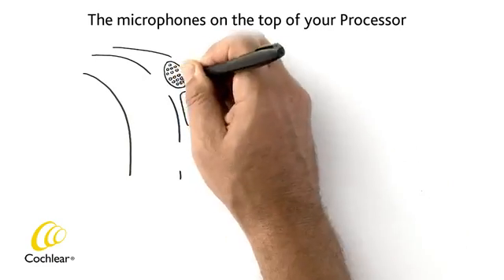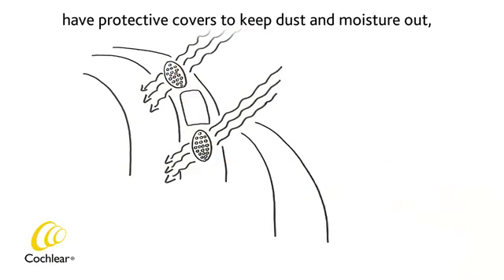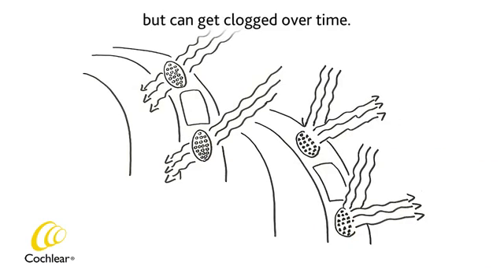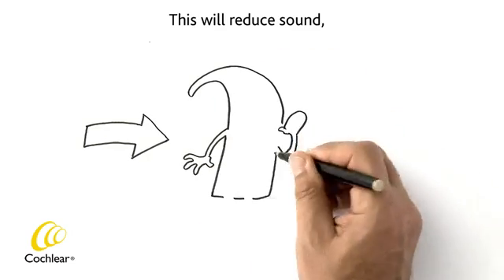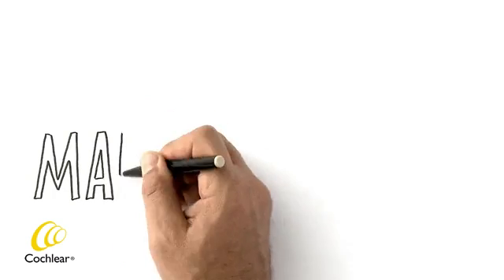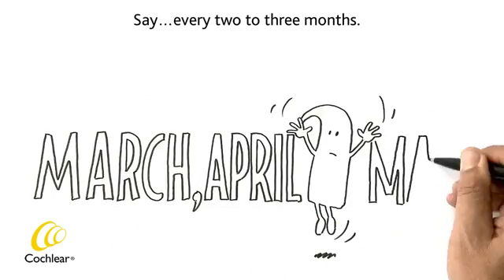The microphones on the top of your processor have protective covers to keep dust and moisture out, but can get clogged over time. This will reduce sound, so change the microphone protectors regularly — say, every two to three months.